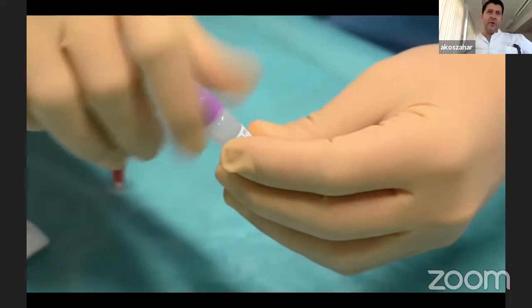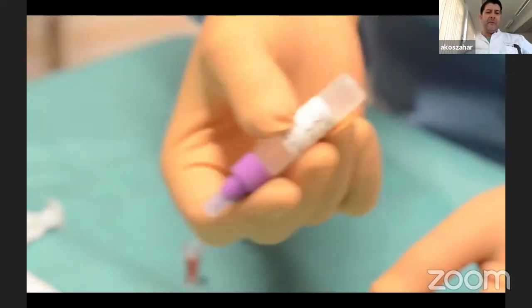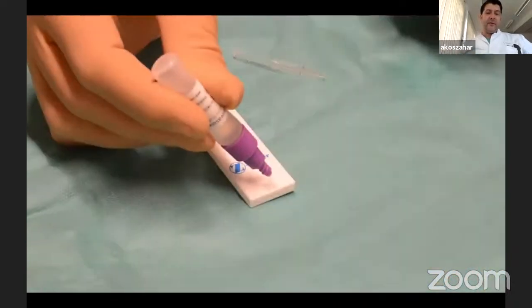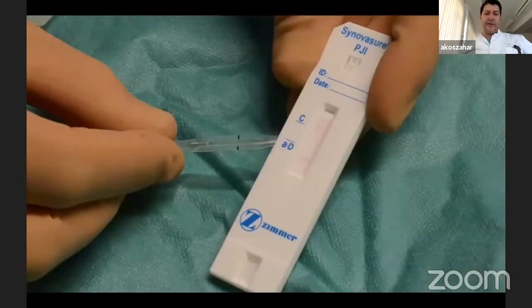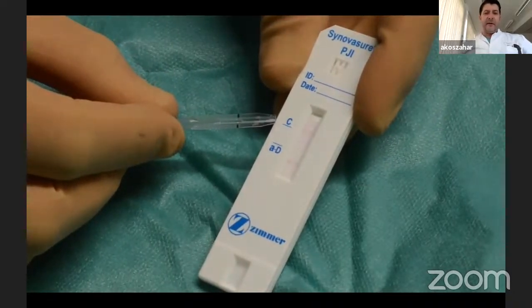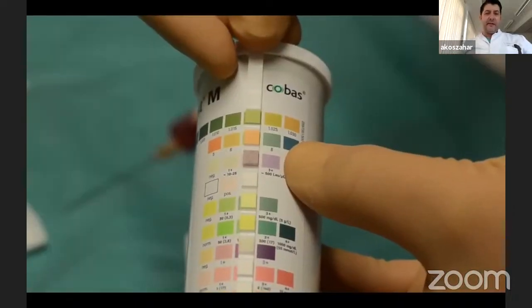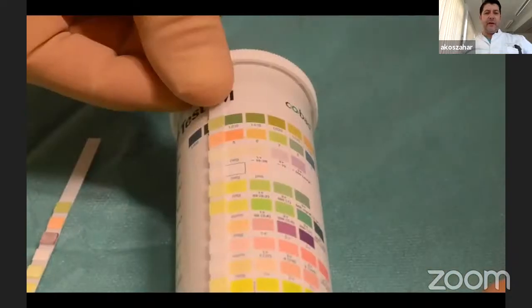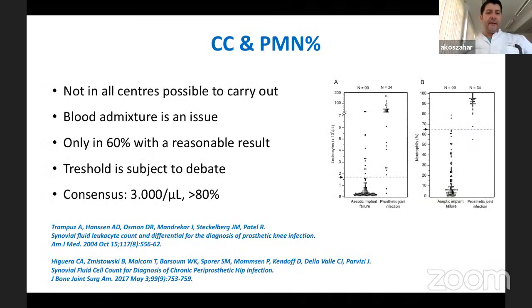If it's positive, it could be infection, but to be honest, it can also be metal on metal wear, for instance, or any particle wear. So if it's negative, you can be quite sure it's not an infection and not an inflammation. If it's positive, you have to analyze other parameters. The leukocyte esterase test, which is carried out here in this video, is very easy and very cheap to carry out, and you can find the positive cases with quite a good sensitivity and specificity.